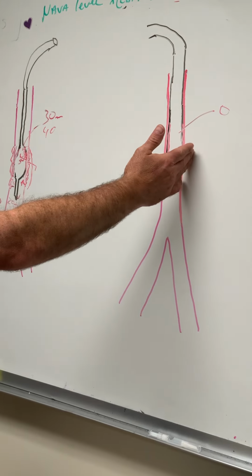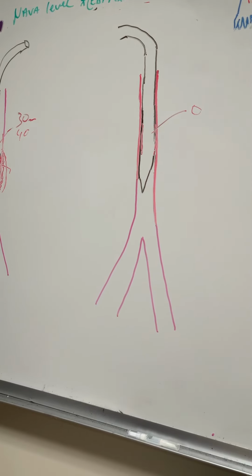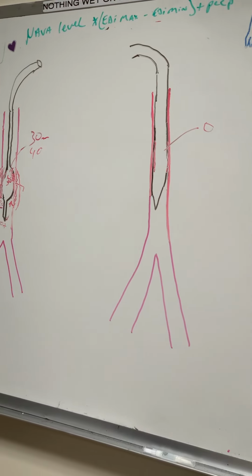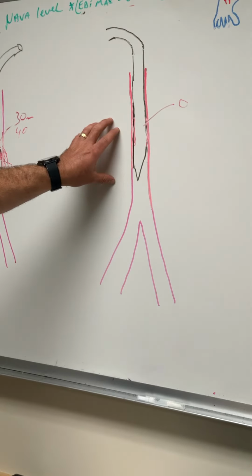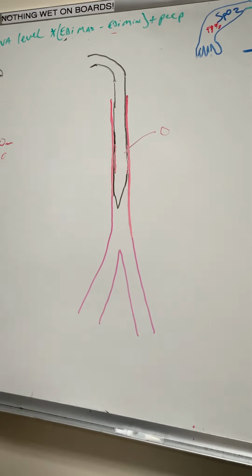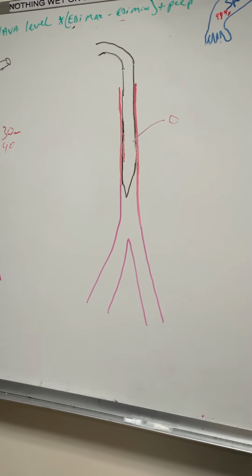However, if we do our leak test on this trachea and we find that the leak is at, say, 28, it has to go all the way to 28, which we're going to show in a minute, before we hear a leak, that increases the odds that when we pull this tube, he's going to have blood rush into this airway, his tissues fall into itself and cause stridor and possibly respiratory distress from it, okay? So we measure it, and if it's above 20, say it's 25, 26, we notify the physician, and maybe they decide to start steroids on this patient, anticipating that that could happen, so we give some steroids before we actually pull the tube.